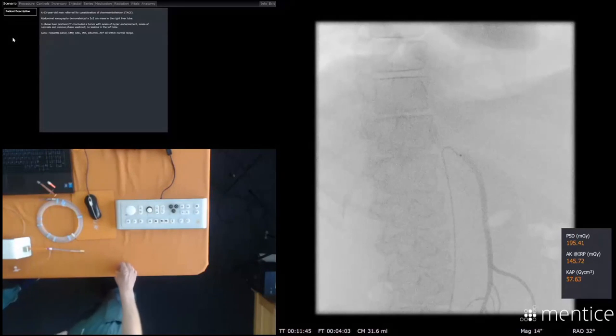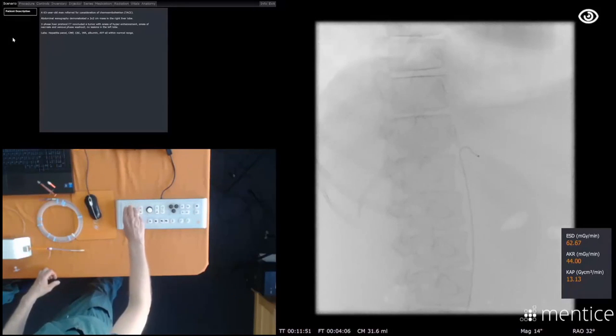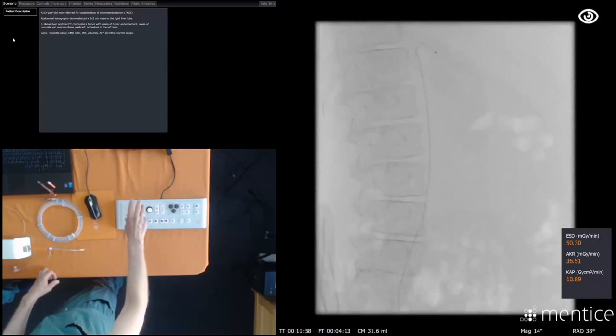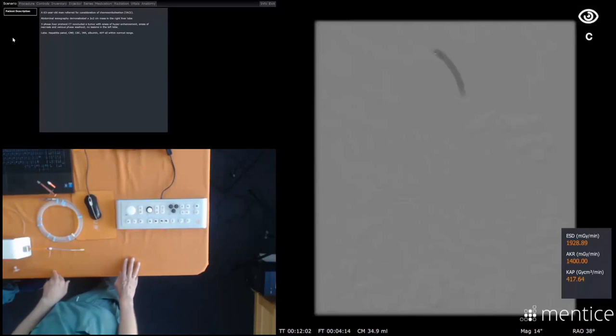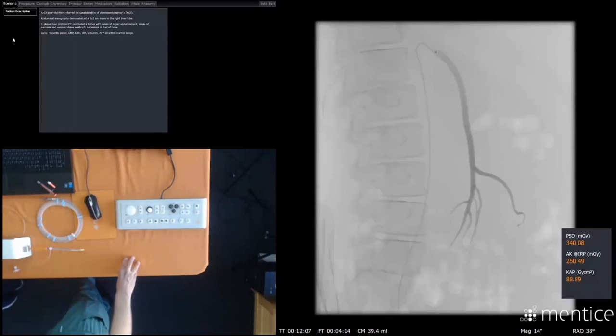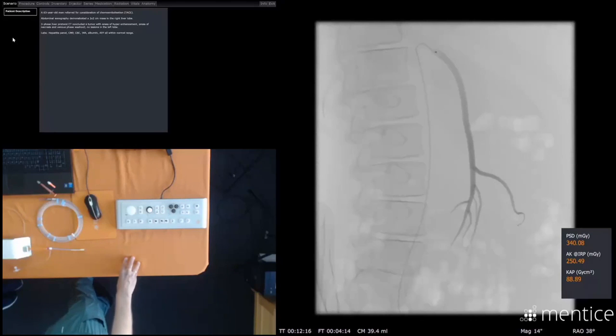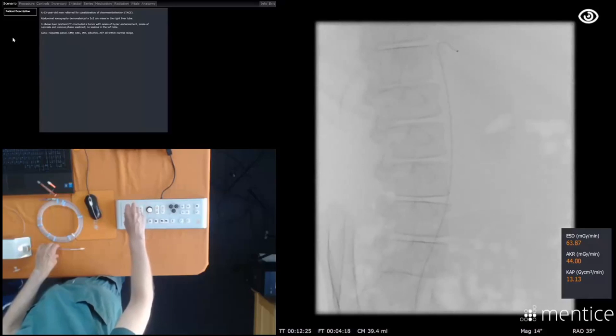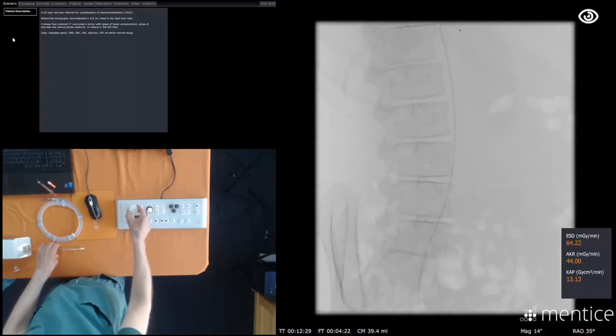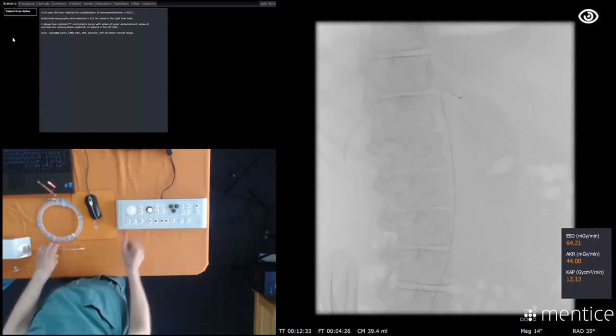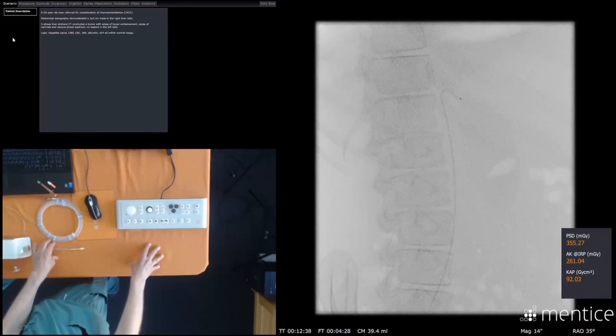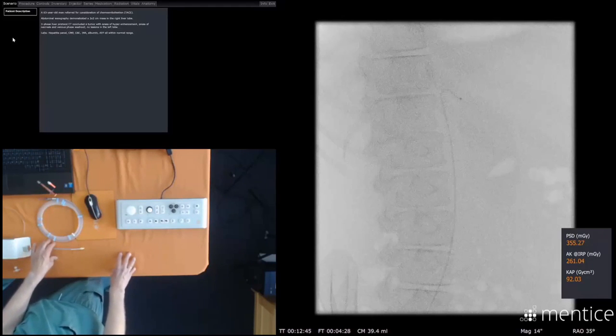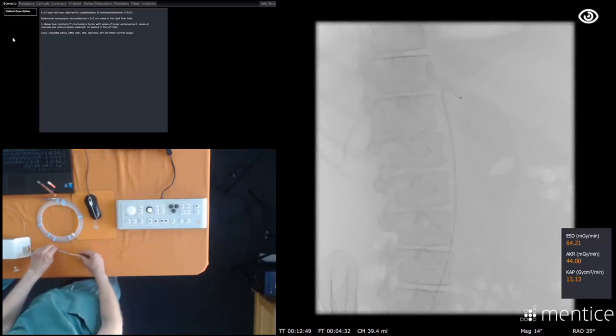We don't need to see the mesenteric artery really, but we can perform a DSA there anyhow just to see how the protocol side works. Would you go ahead, please? This is a protocol of the SMA, and now you see, I think that's a tick box. That is what we have done. For the seeding, we could see that there were no liver arteries going from the mesenteric artery, so we go up to the celiac again. That's a little bit strange how it works.